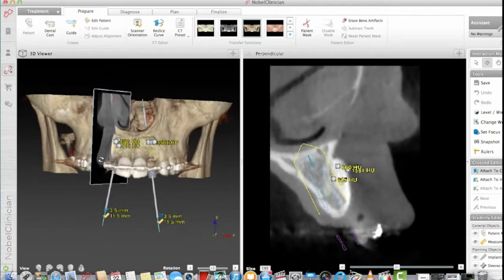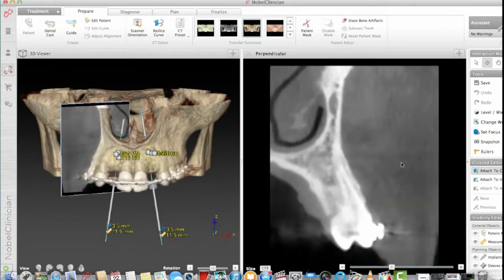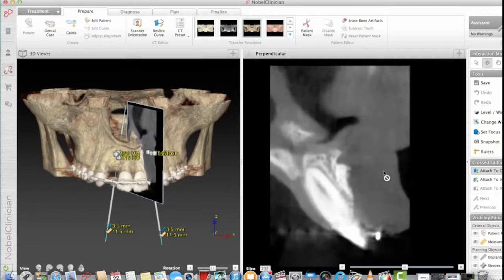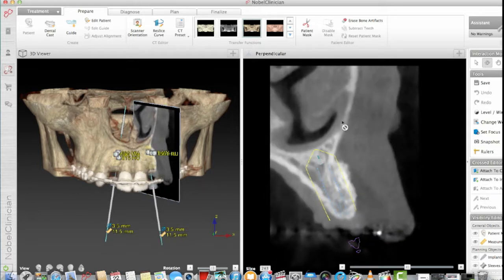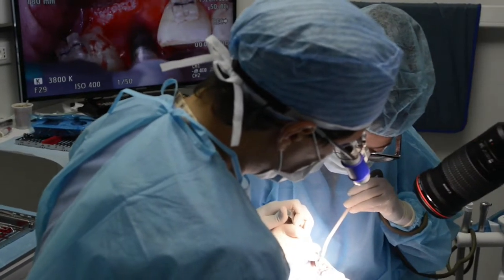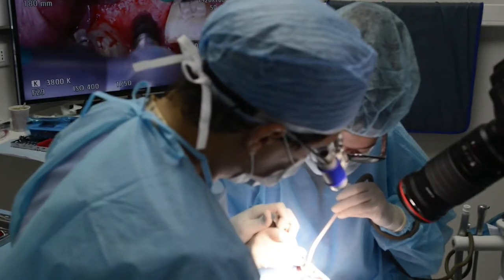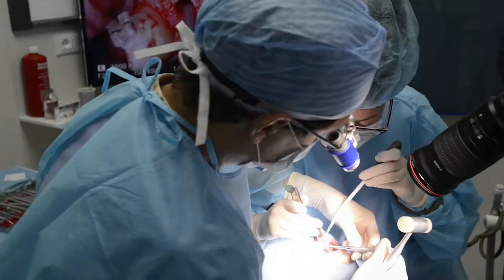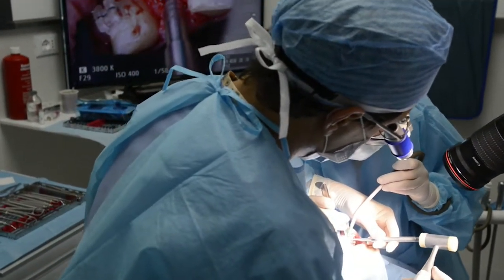Now here we see the augmented bone, and I can measure and calculate all my surgical variables. And based on the anatomy, I can even look at the implant that I'm going to choose in order to get the highest primary stability as possible. So what is happening in daily practice when we do this type of bone augmentation? We do see a bone density that is resembling the bone density of the donor sites. So where I took my bone chips from, which is generally the anterior nasal spine or tori or the ascending ramus. And I need to use osteotomes here.